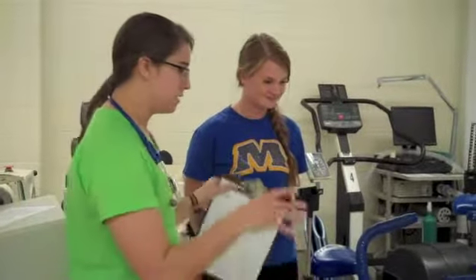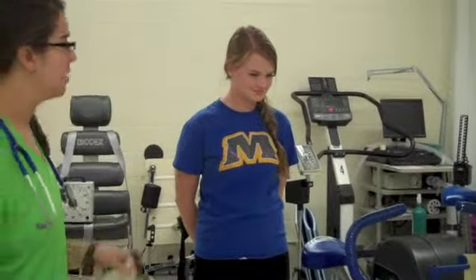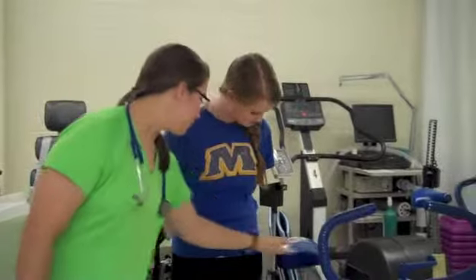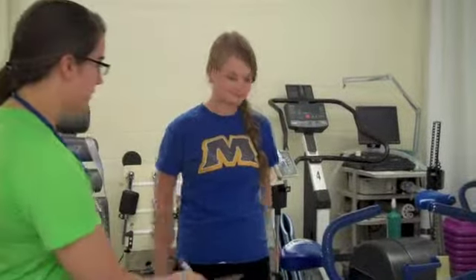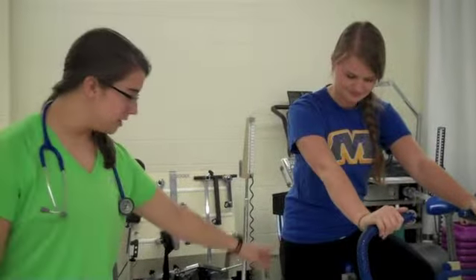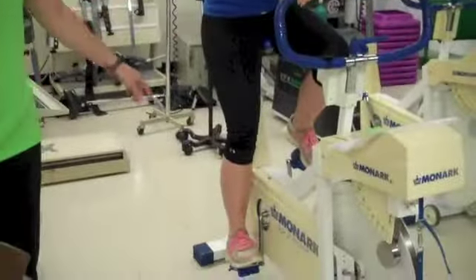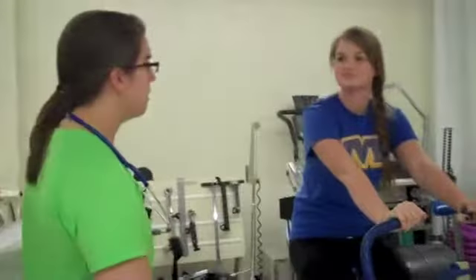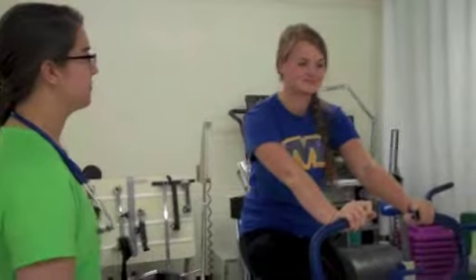Alright, so this is our cycle ergometer bike. It's just like a regular bike, except I'm the one that's going to up the resistance on you. So the bench is going to be level with her hips. Go ahead and get on to the bike. That way when she is fully extended here, her other knee is bent at 25 degrees. So Ashley, go ahead and warm up for about 2 to 3 minutes.